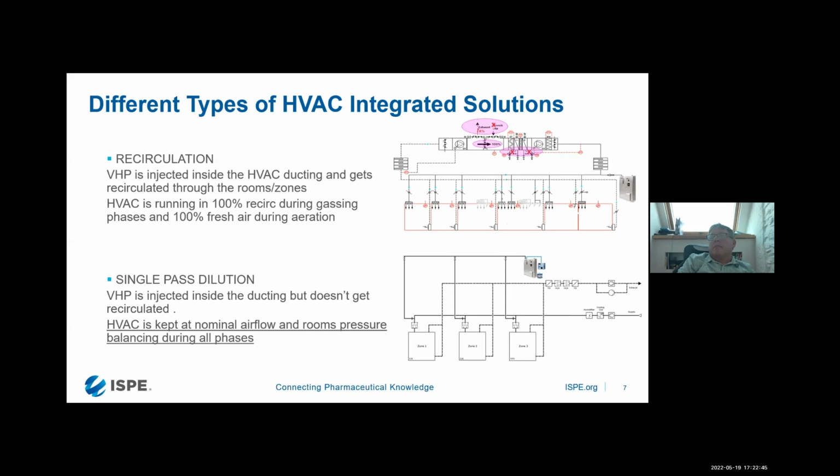Okay. Are there any more questions? Yeah, sorry, Bruno, this is Paul. That was my question. Sorry, just to confirm, if the HEPA housing is isolated, how is the aeration performed if we have no exhaust from the housing? Sorry, can you repeat? Sorry, yeah, so if we're performing a decontamination on the exhaust housing when it's isolated, so there's no airflow, how is the aeration occurring if there's no exhaust flow through the HEPA?